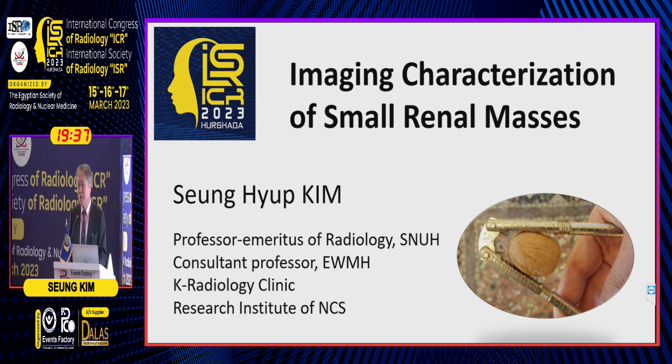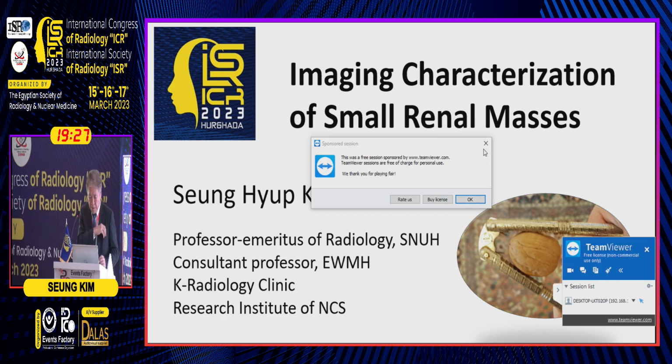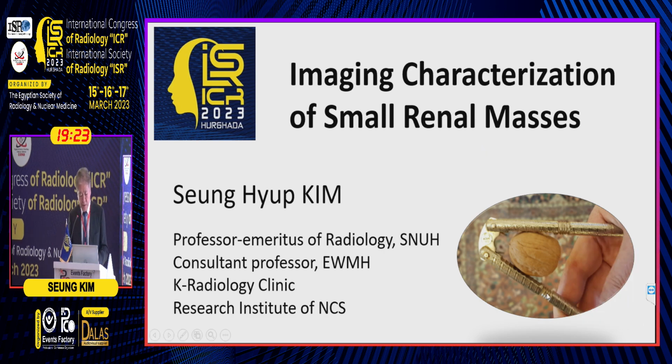In our daily practice, with ultrasound or CT, often we encounter many cases of indeterminate small renal masses.